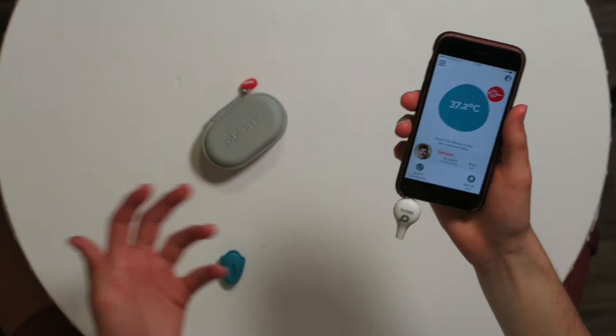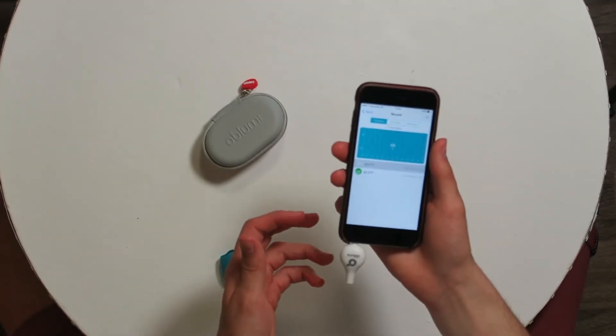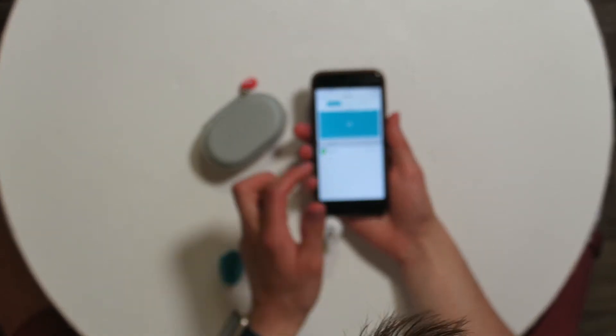It's now in my ear and I'm measuring the temperature. I think it's reading 37.2°C. My forehead temperature was 37.3 and my ear temperature is 37.2 — that's very consistent and very good.